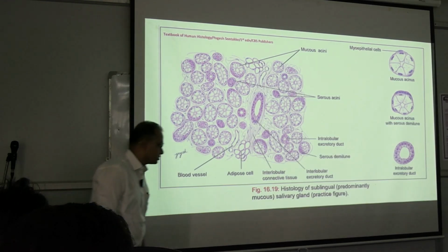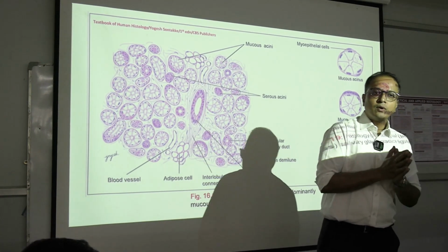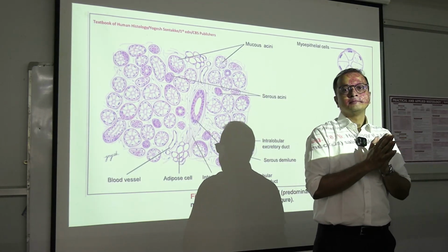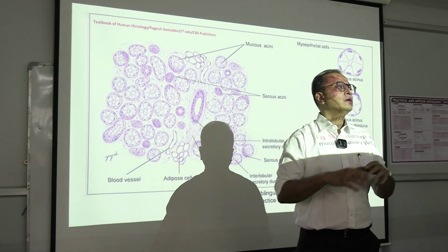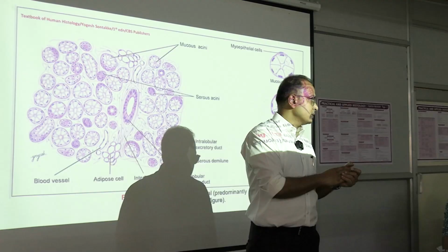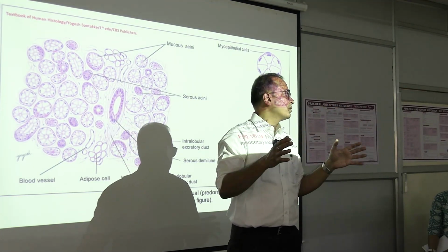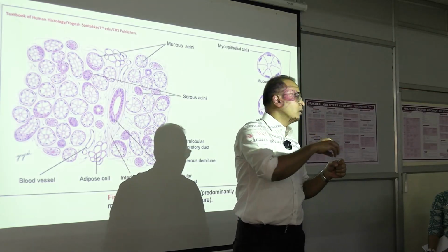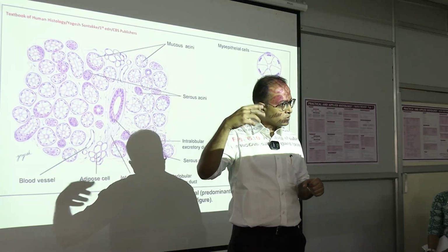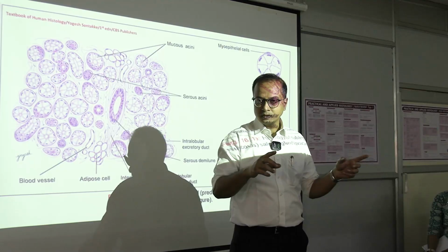Okay. So, once again, you summarize and go hit the microscope and see it yourself. What are you going to see? Salivary gland. What do we expect to see? Secretory unit and duct system separated by partitions, connective tissue, A, B, C. First you identify which one is a secretory unit. If the secretory unit is separated from others, that makes it a lobe. Within this lobe, we are going to see two elements. One is the acini which produce the secretions. Either it will be dark stained or light stained, that makes these things, or a mix.